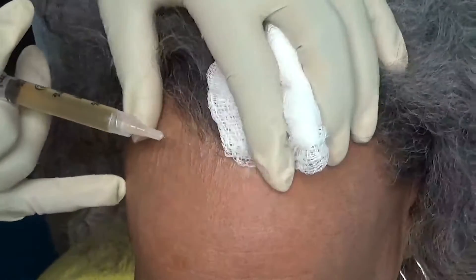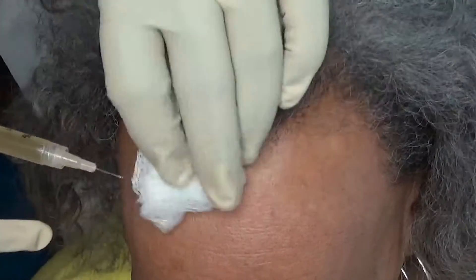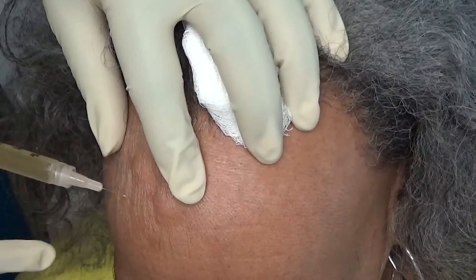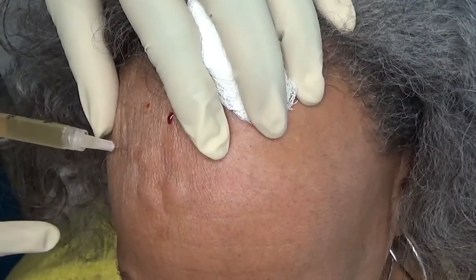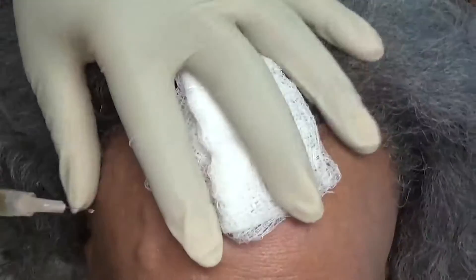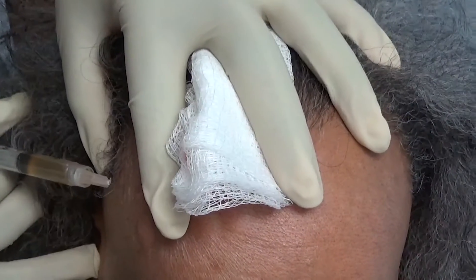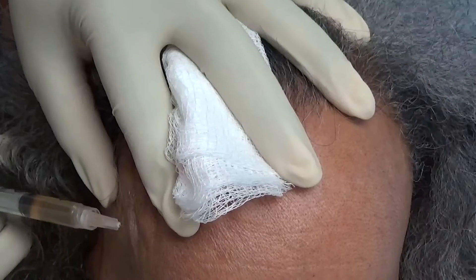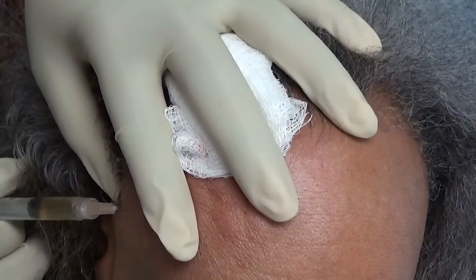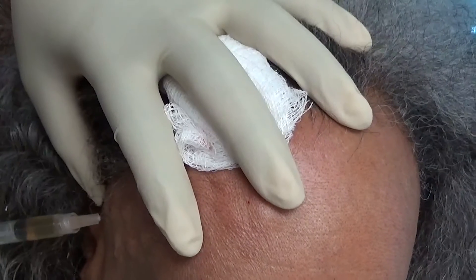All right, here we go. We're just going to inject, and like I always say, the quicker we can get this done, the less pain for the patient. We just checked with our patient — she says she's doing great, doing somewhat great, doing a little great — but it's not bad. She said it wasn't too bad, so we're still good. We did do her numbing cream.